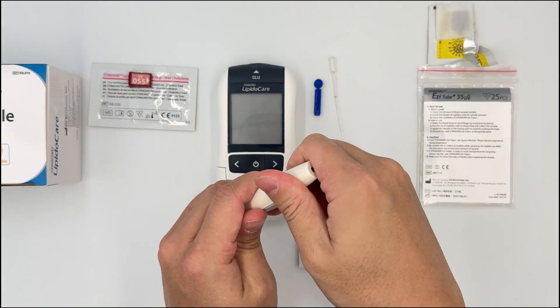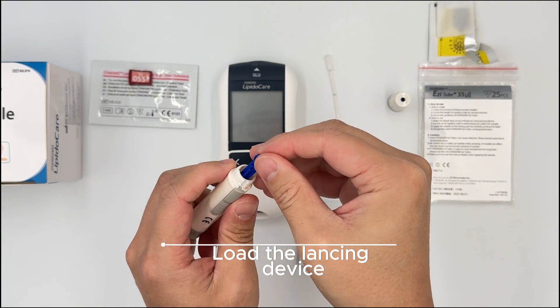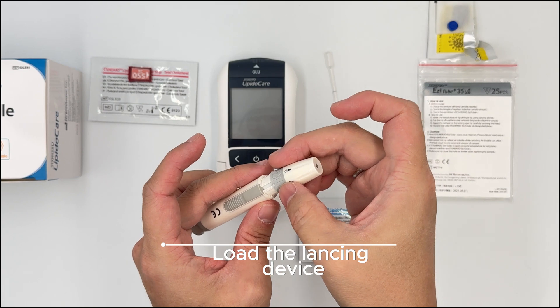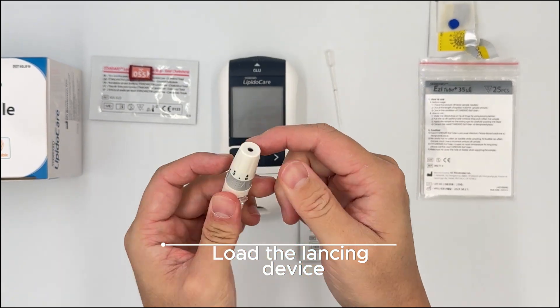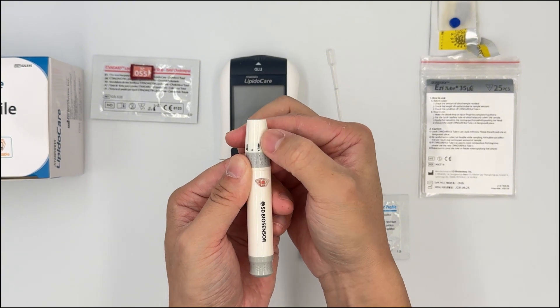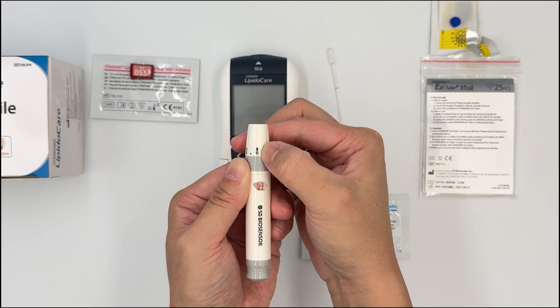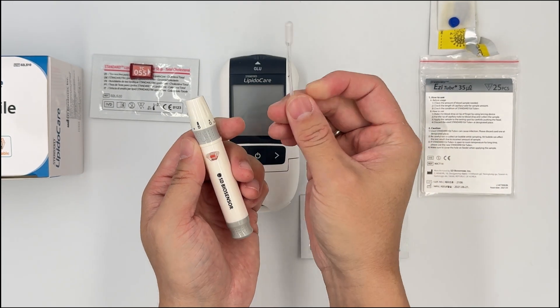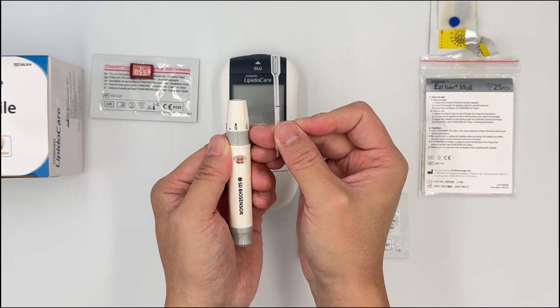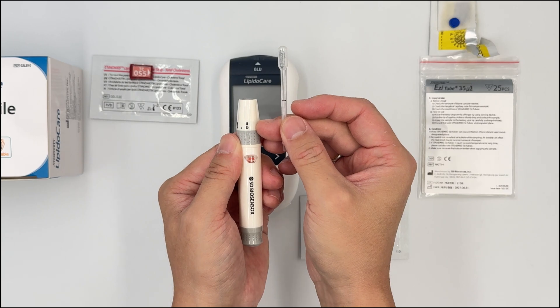Next, prepare the lancing device. Set in the lancet and cover it back. Make sure that you prick on the deepest level — number five — because later on you're going to take a sample of 35 microlitres. To make sure you get it on the first time, we recommend putting it on the highest level.